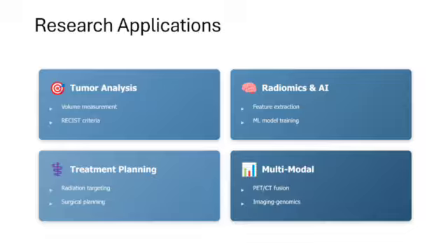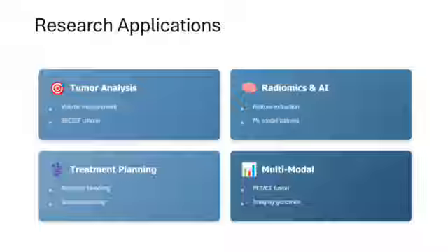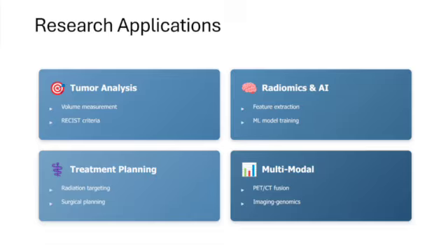Treatment planning. This gets more into the clinical aspect, but we have clinicians that do use the CGC for research purposes. So if they're planning out protocols or making new scripts, that would be very useful. And of course, ultimately, multimodal: PET and CT fusion and imaging and genomics. We're seeing a lot of excitement around that.